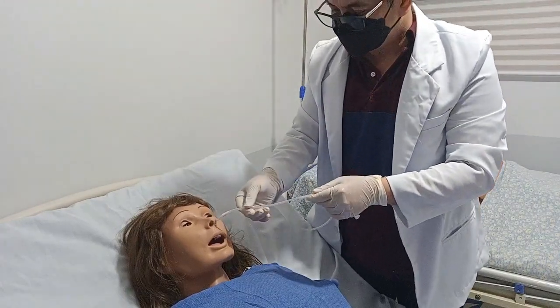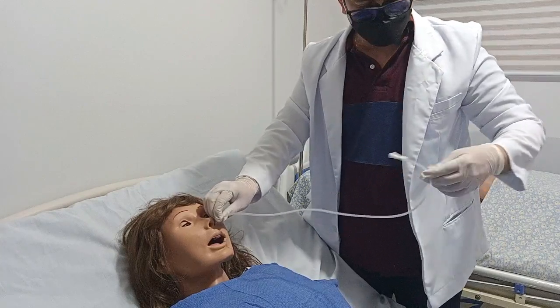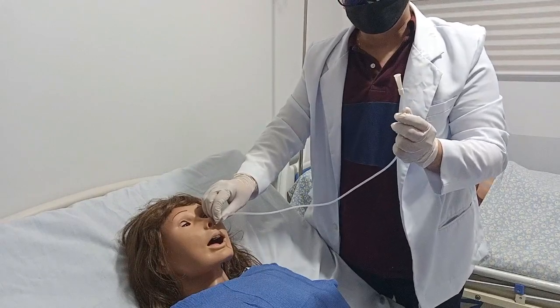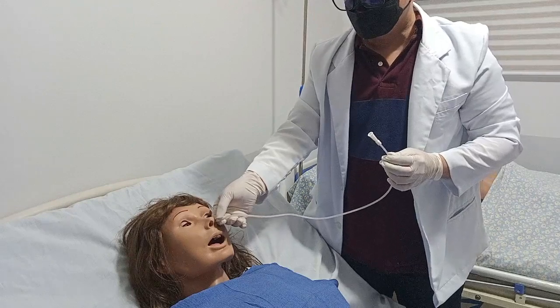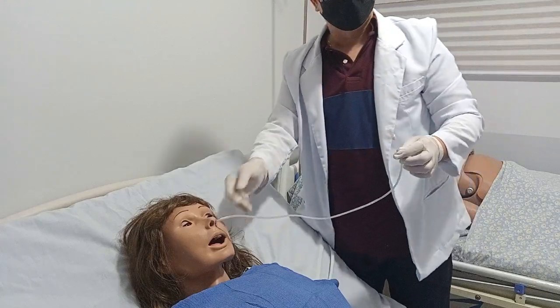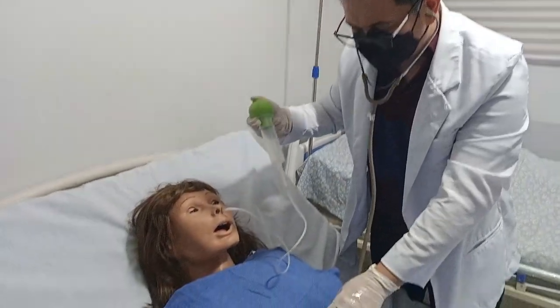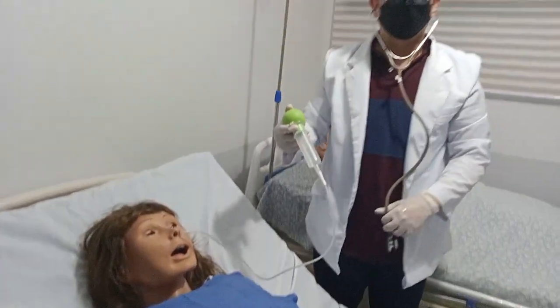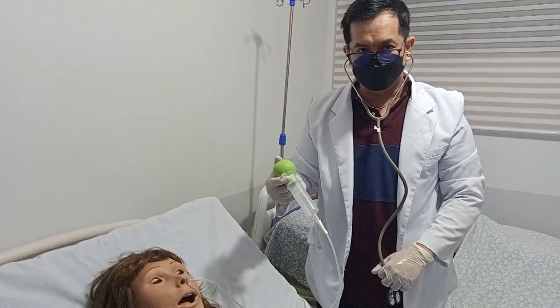Ascertain the correct placement of the tube. You can aspirate the stomach contents and check the pH, which should be acidic. If you do not have a pH strip, you can use an x-ray, or you can use the stethoscope. Place the stethoscope over the client's epigastrium and inject 10 to 30 ml of air into the tube while listening for a whooshing sound. If you hear that sound, you can be certain the NGT has been inserted into the stomach and not into the lungs.